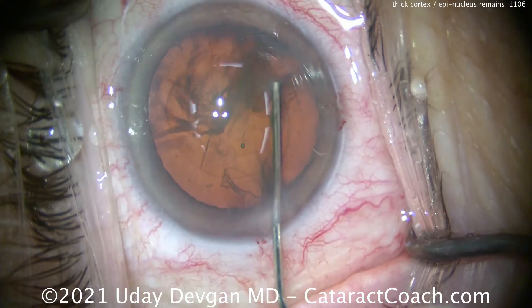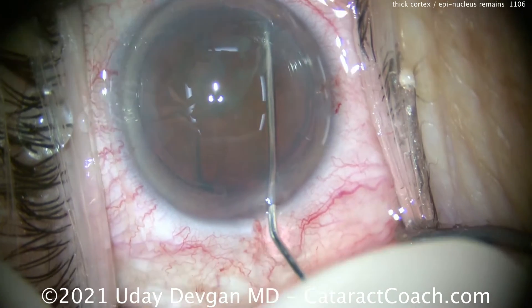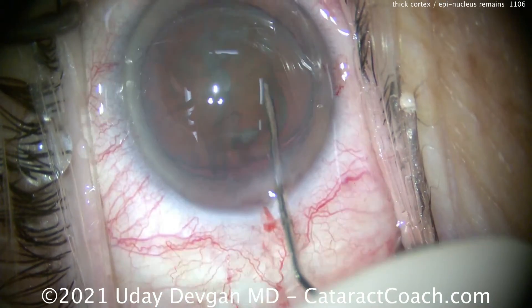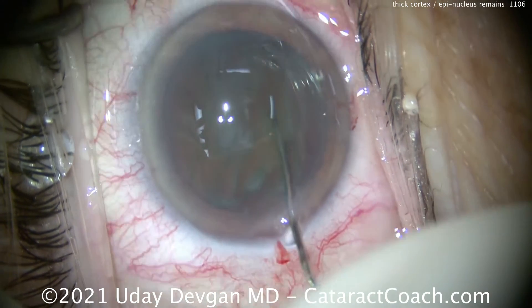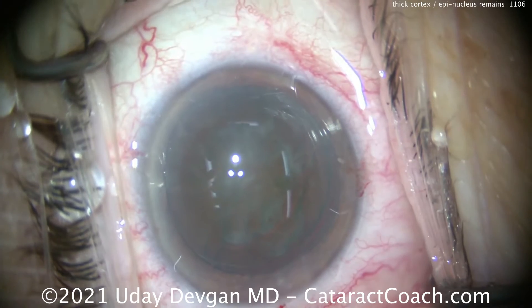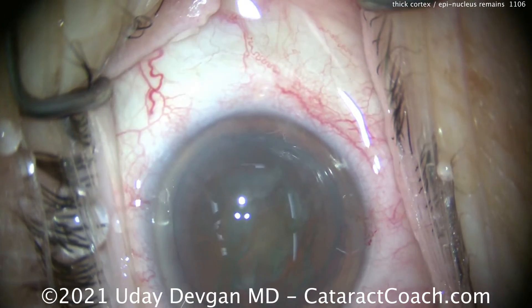The key of hydrodissection is to separate the capsule from the lens material. But you see that golden ring? That is hydrodelineation. So what we've created is a big endonucleus. We've got good hydrodelineation done, but I don't think we did enough hydrodissection.